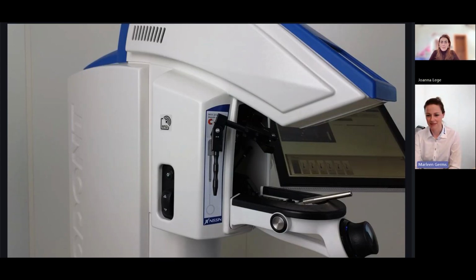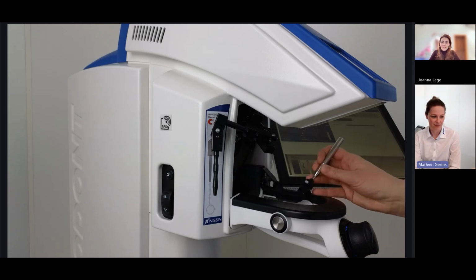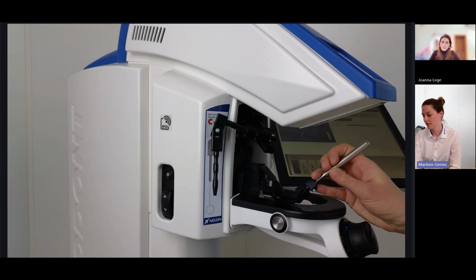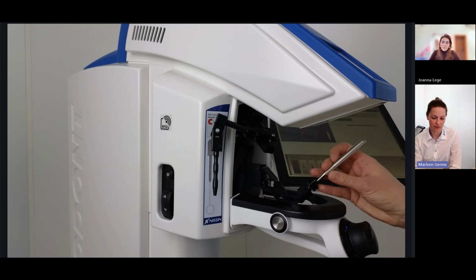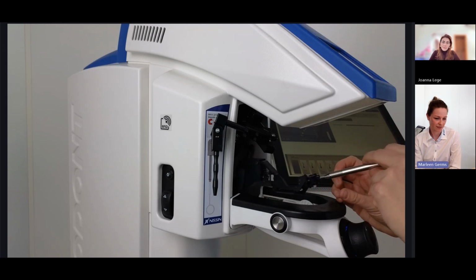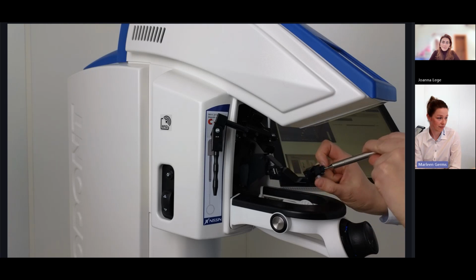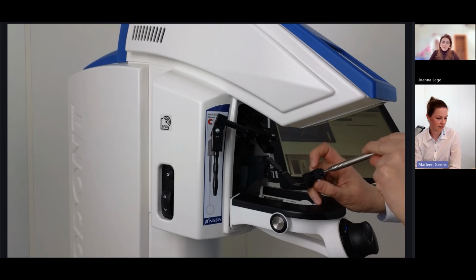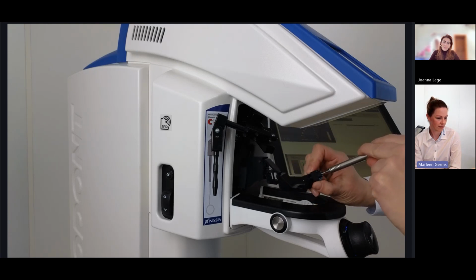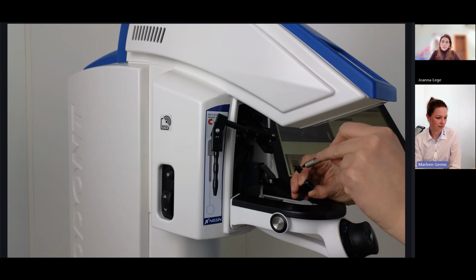Thank you, Joanna. You might have already noticed that while giving the demo, I used a different handpiece than the handpiece that you all are used to. This is the shortened perio handpiece. I'll now show you how I can exchange this with the drill handpiece. So there's a white button here at the adapter piece, and I'm going to push it. And then I'm going to slide the straight perio handpiece in the opposite direction.